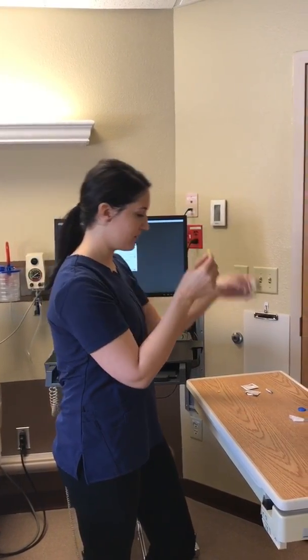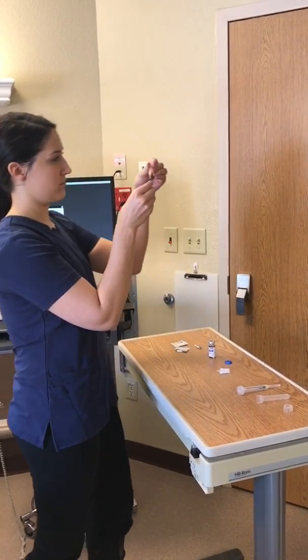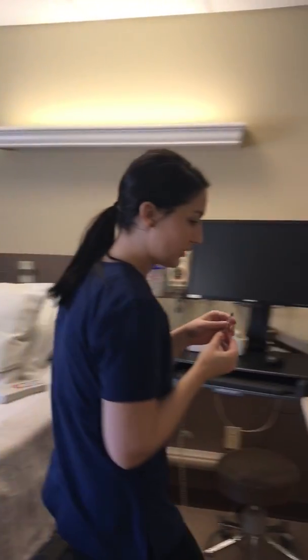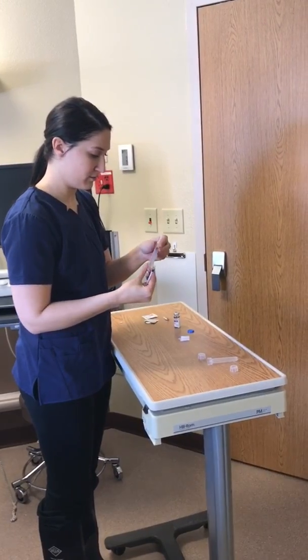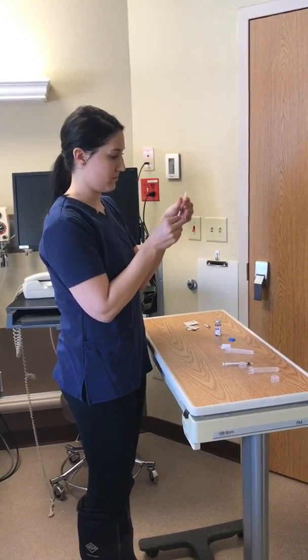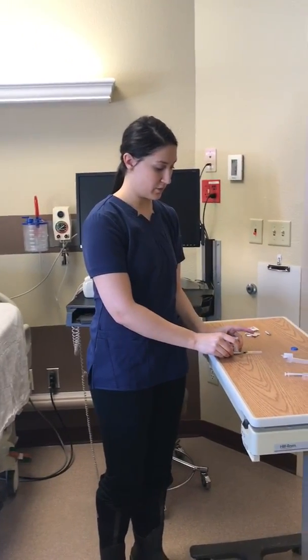Go ahead and take that off. I'm going to recap my needle, and then remove that needle. I'm going to dispose of it in the sharps container. Okay, the next thing I'm going to do is reapply a sterile needle. And then I'm going to go ahead and take my vial and my syringe, and we're going to head into the patient room.